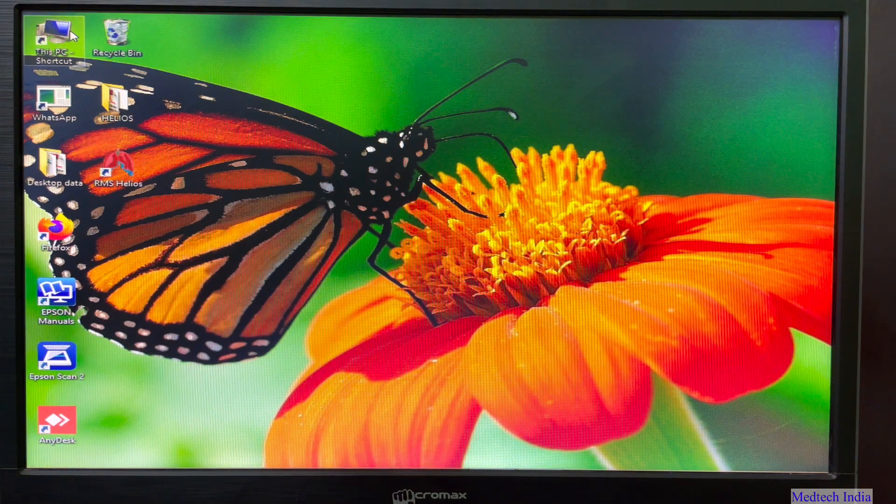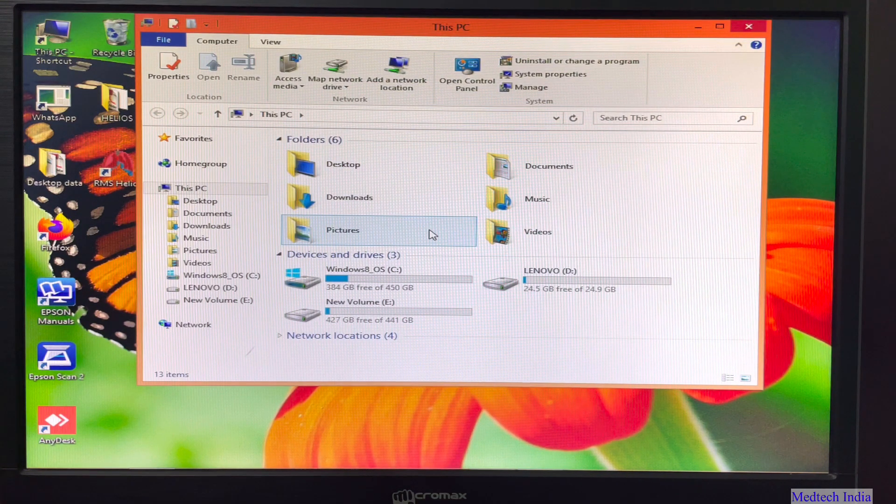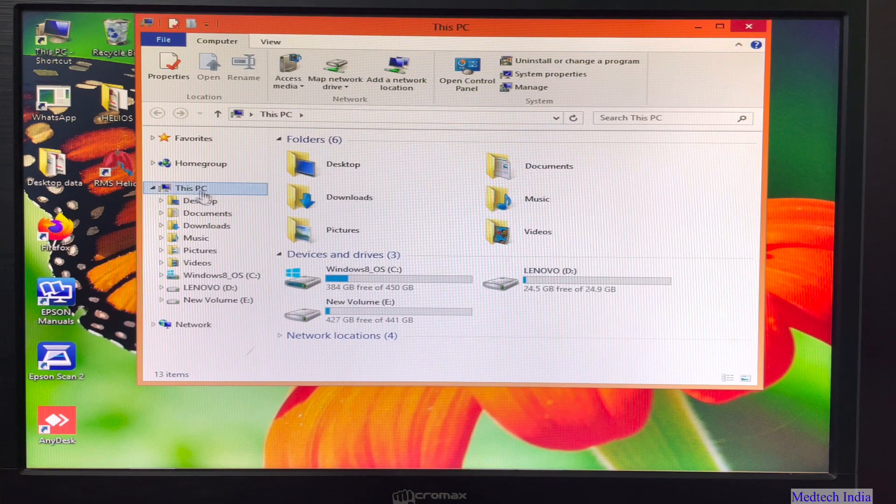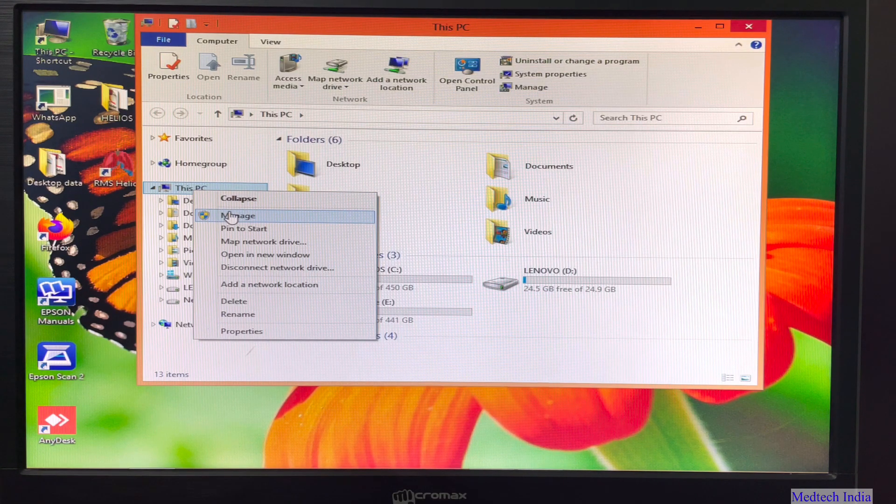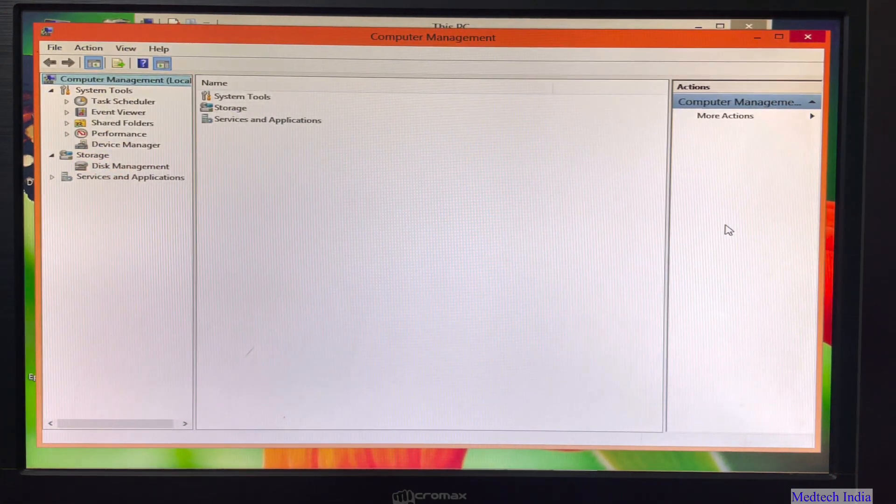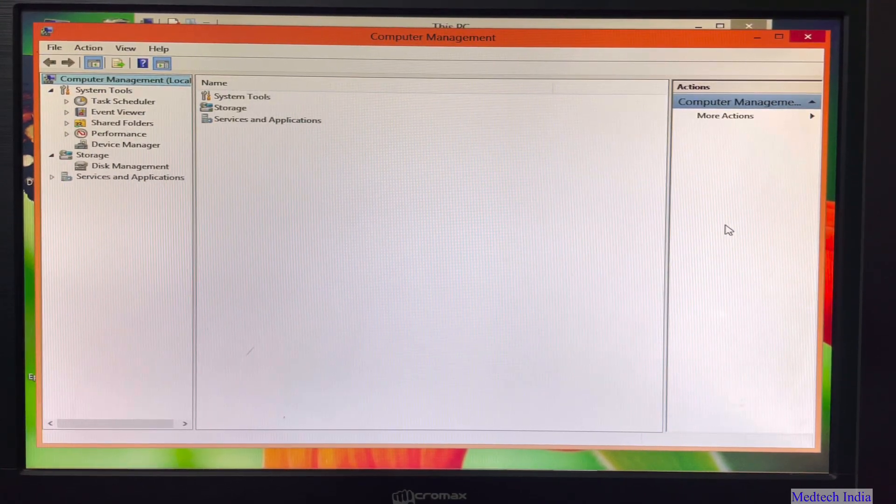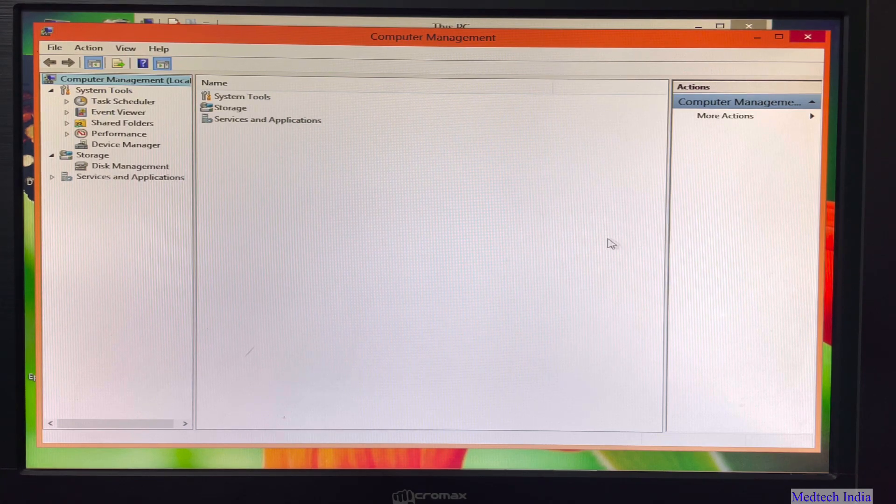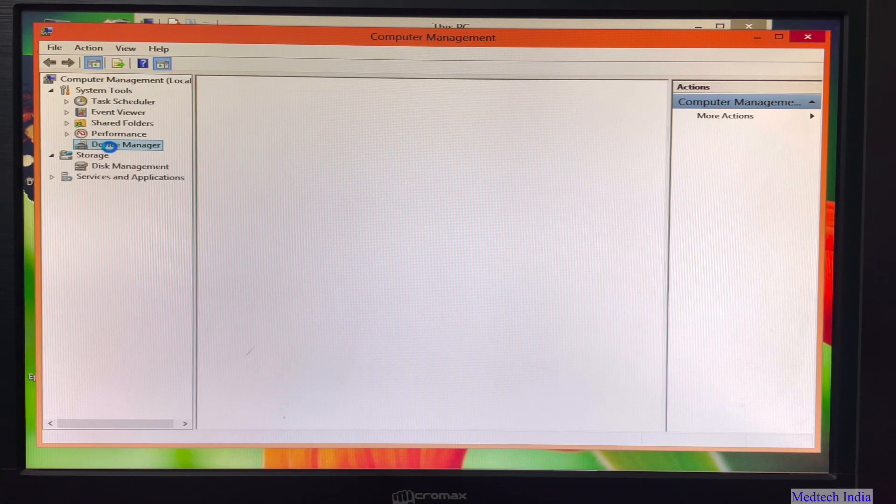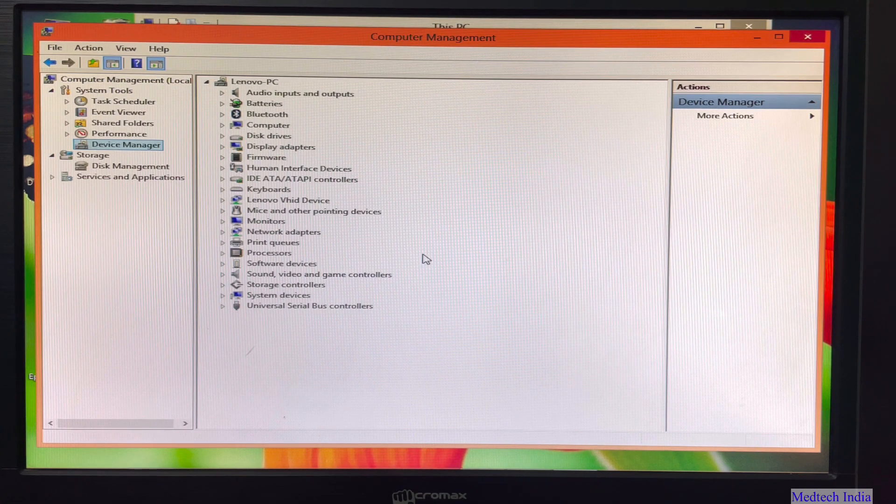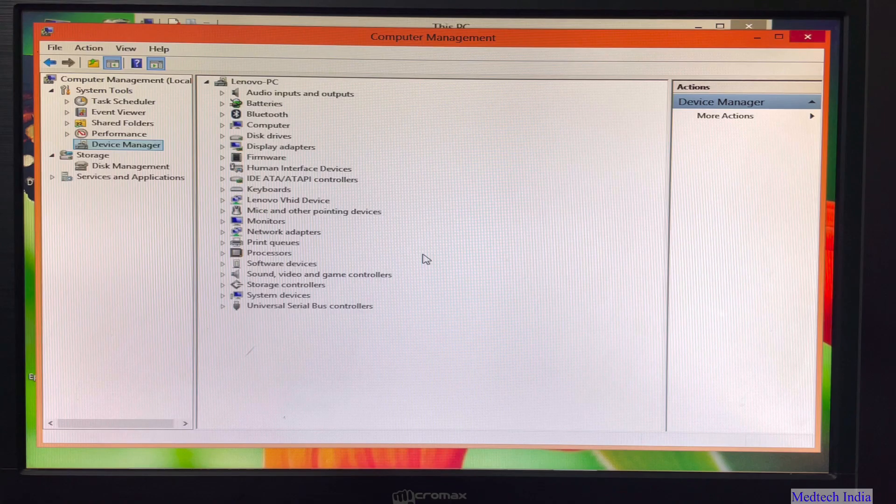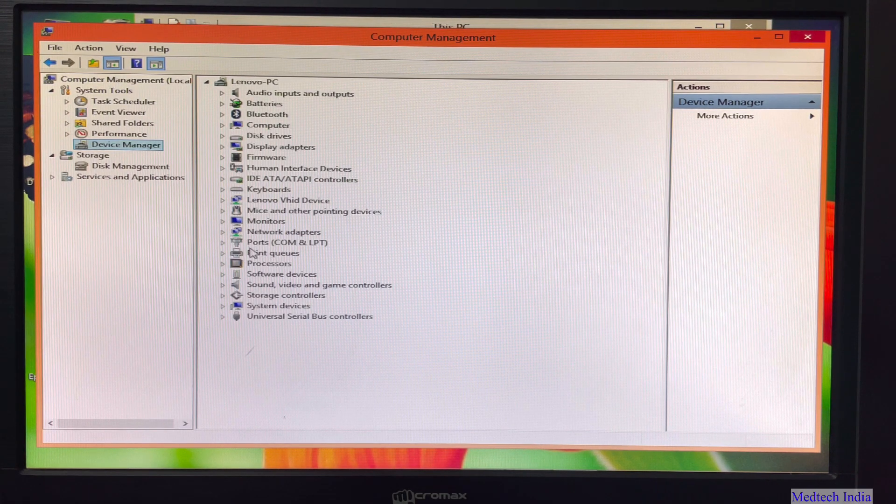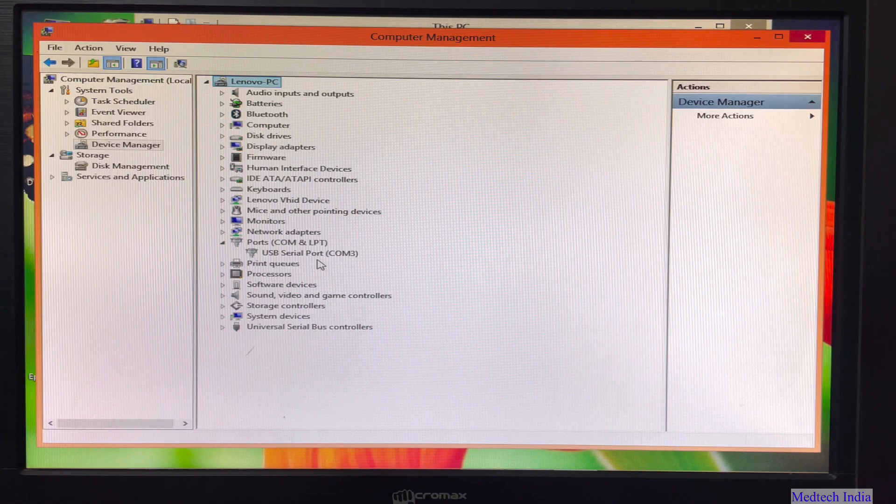Now we need to click on my computer icon. Then left side, you will get one icon, This PC. So right click on that. Just click on manage option. So after clicking, one computer management window will pop up. Then click on device manager. So after clicking, you will get various options. If you have not connected the device USB cable to system, please connect it. So after connecting, you will get the options ports, Com and LPT.